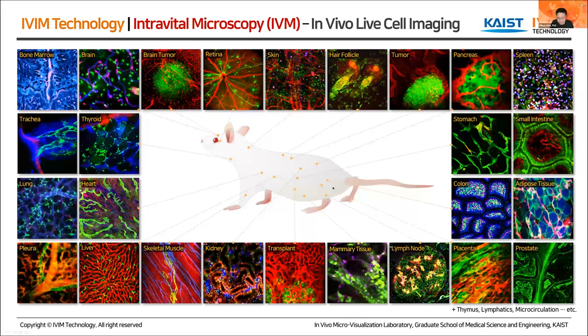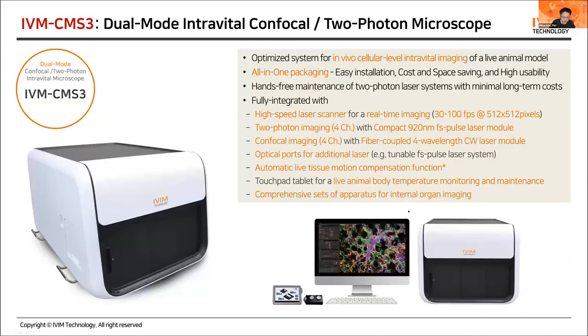Well, I cannot put every image in here, but basically, we can image almost every organ and tissue in a live mouse model in vivo after some surgical preparations.